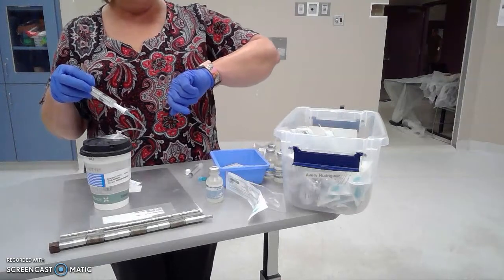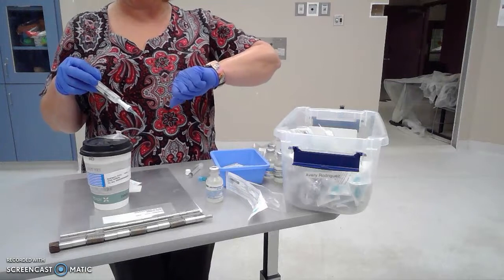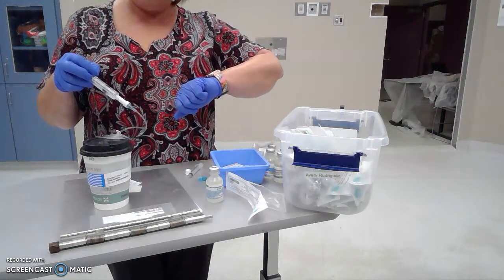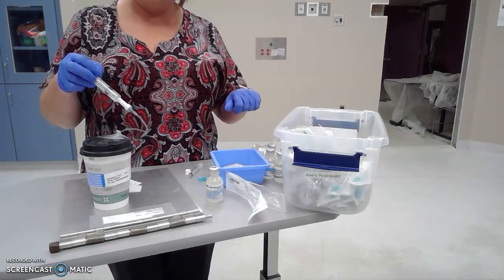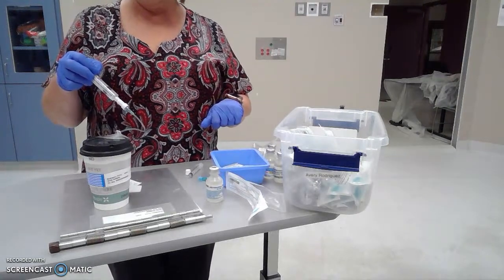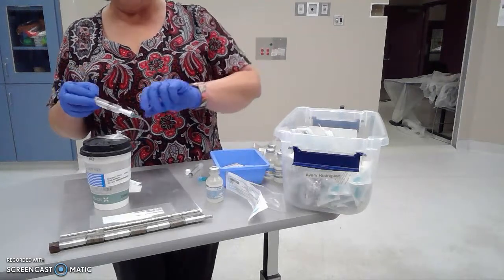0.25, and I wait 15 seconds. And again, for sake of time, I'm not waiting the whole 15 seconds. I do another 0.25. 15 seconds later, another 0.25. 15 seconds later, another 0.25. So I've pushed 1 milliliter over 1 minute.